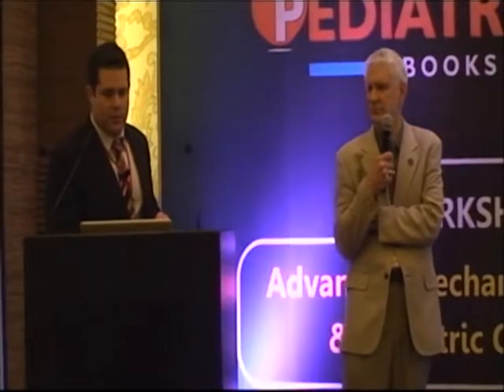So Rob, what is the PO2? So we don't really know what the PO2 is. This is going to be your capillary PO2. Capillary PO2. And so this does not necessarily reflect what your PaO2 is, right? So this will generally read 20 to 30 lower than your arterial PaO2. But it does mean something. Yes.